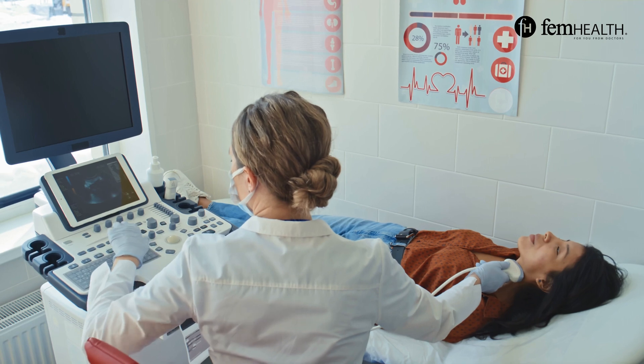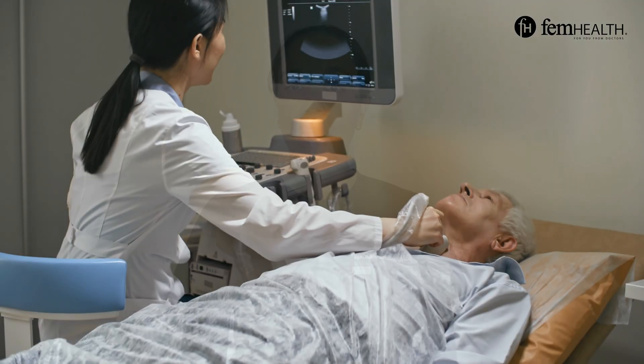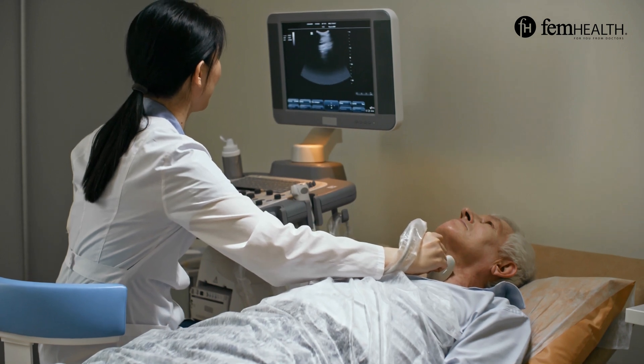During the procedure, you'll typically lie on your back with your neck extended to expose the thyroid gland. Your doctor may use an ultrasound to precisely locate the thyroid nodule. This will help to guide the biopsy needle to the correct spot. Ultrasound can help to ensure accurate targeting and minimize the risk of damage to nearby structures.